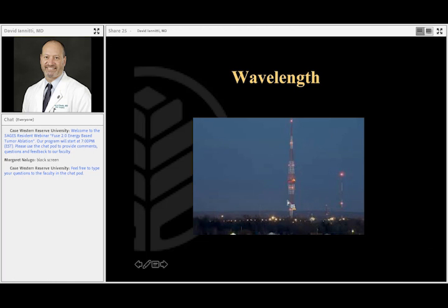When the tissue, the tumor, interacts with something of a wavelength that long, how does your body see it? You see it in the form of particles, in the form of electric current. What if we said we don't want to see electric current? Why don't we match the wavelength to the size of the ablation that we want? If you say I want a wavelength around 3, 4, 5 centimeters because that has clinical relevance in the liver world, and you calculate the frequency, that puts you in microwave frequency.